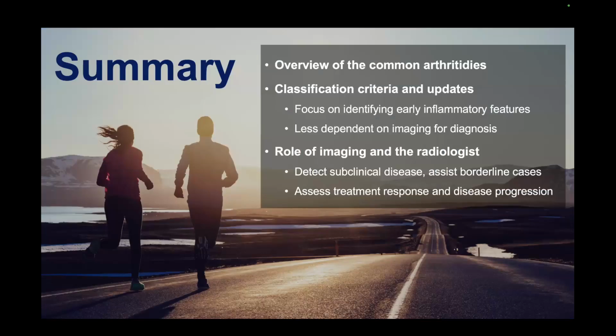So hopefully in this talk, we went over some of the common arthritides with you and highlighted the key radiographic changes, as well as some of the MR changes of looking for early signs of inflammation. Unfortunately, I don't have very many ultrasound cases to share with you, but in a future talk, I'll have more saved up in my bank. But really, ultrasound and MR can be used synonymously in peripheral joints, but MR is pretty much the mainstay for spine imaging.